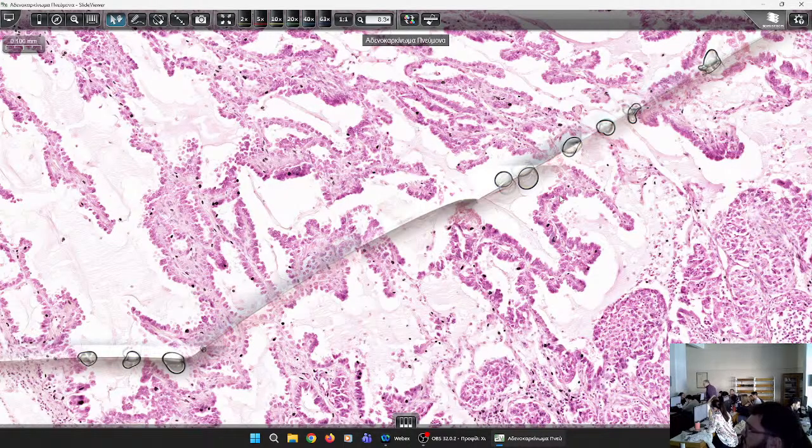What would the patient die of? He would die of asphyxia, because all these parts of the lung could not function and have gas exchange, so he would not die of metastasis or some other cause, but of asphyxia.